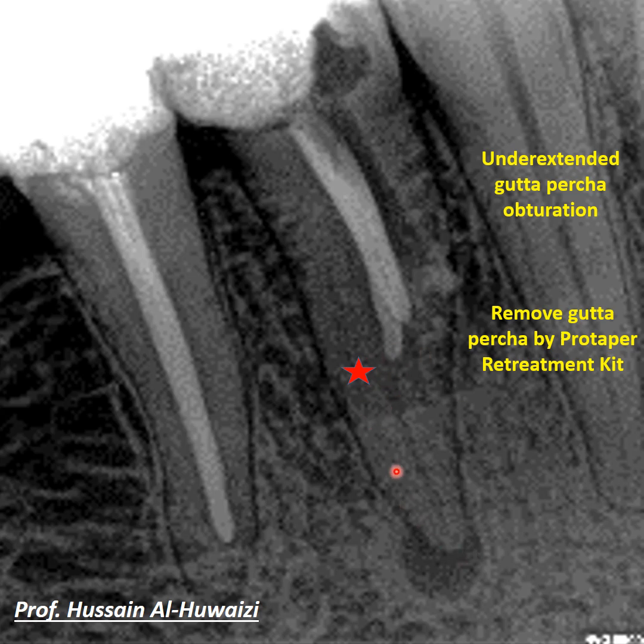The underextended gutta-percha was removed using the ProTaper retreatment kit to open up the canal so that we could instrument the apical region that was previously uninstrumented and unobturated. The canal was then irrigated and cleaned again with sodium hypochlorite and EDTA.